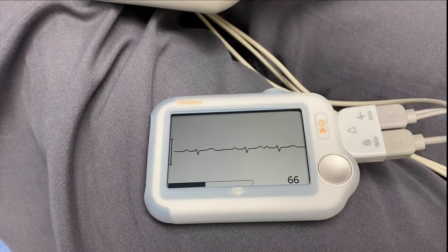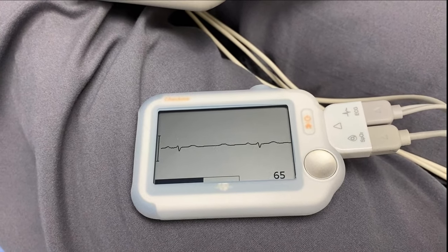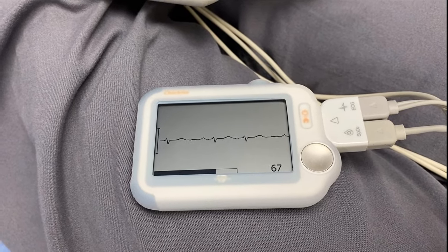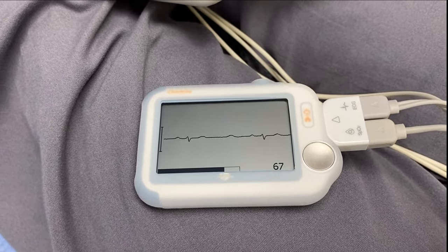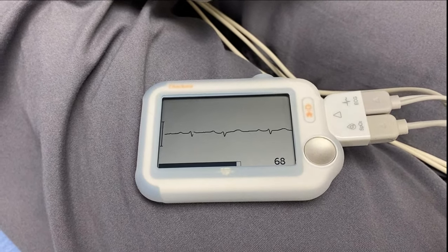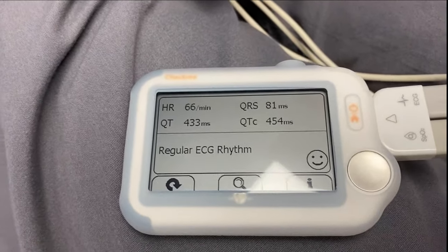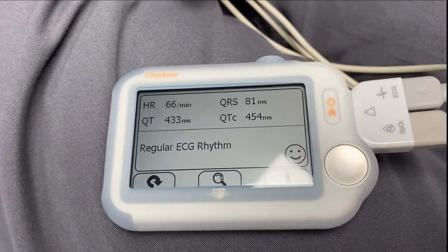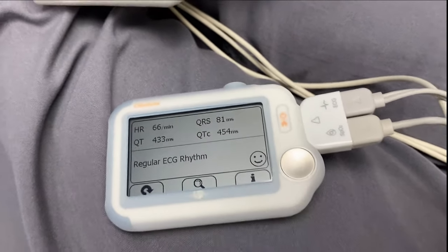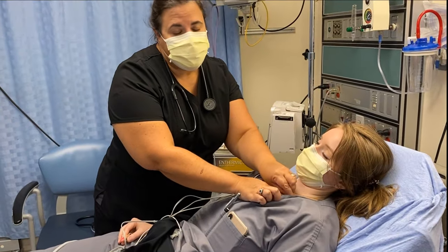Her heart rate is 65 on our machine and 66 on the hospital monitor — exactly the same. What's interesting here is it gives you a QTc — she's got a QTc of 454, QRS is 81 milliseconds. Now we're going to disconnect these leads and do the EKG the other way.